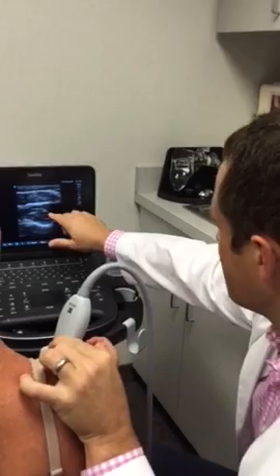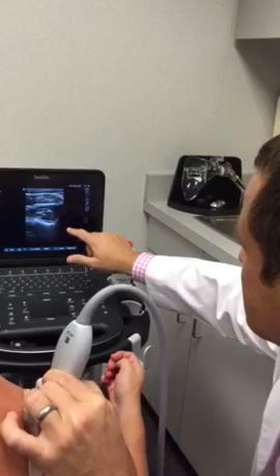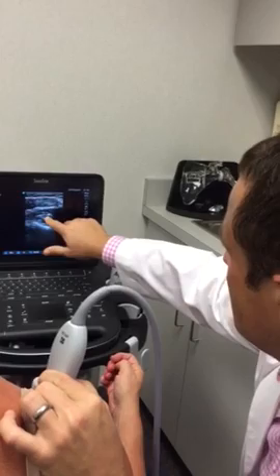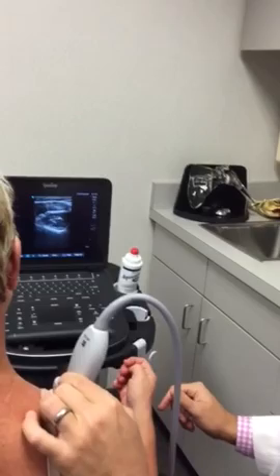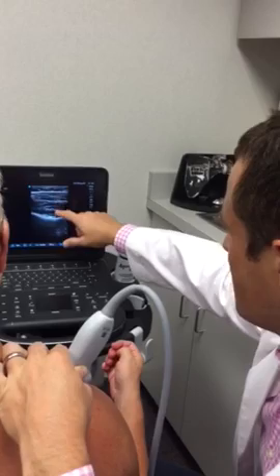You can also do this for the supraspinatus — here posteriorly is the scapular spine and anteriorly is the clavicle, and this is the short axis of the supraspinatus muscle belly. You can see the overlying trapezius; the muscle architecture is the same, but if there's a big retracted tear it will be much more hyperechoic due to fatty infiltration. You can do the same for the long axis of the supraspinatus muscle belly comparing it to the trapezius. As long as you identify the bony anatomy first and continue to work on it, you'll get good at this quickly and your patients will appreciate it.